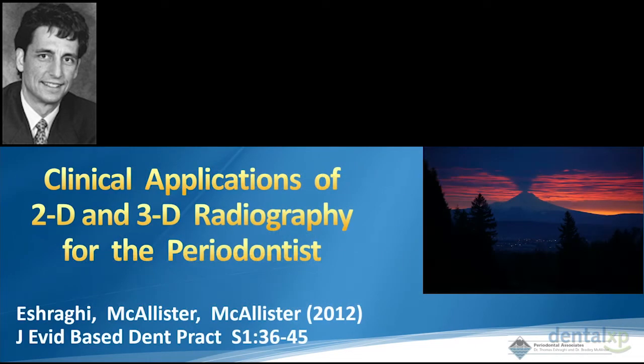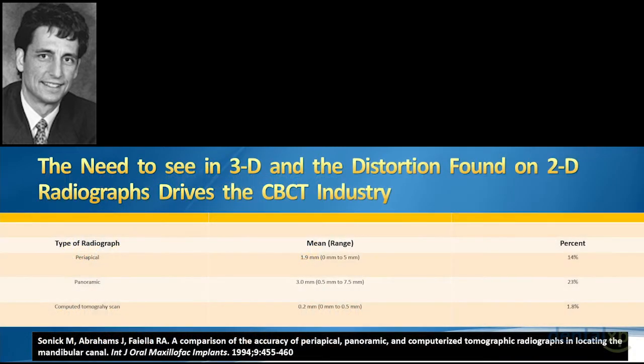So if you're interested a little bit more in the scientific side of it, as far as the dosing of the different units, this is a great article that we wrote that gives a little bit of the scientific side to it. Obviously, today we're going to be very limited in that. But this article gives the rationale again for the CBCT and talks about the radiation exposure and the ALARA technique, and that's part of what we're going to talk about today, but in a very abbreviated fashion.